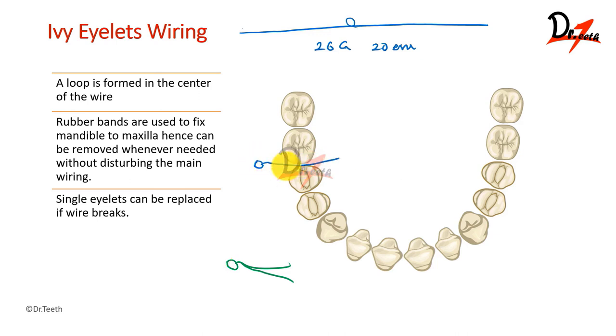We will be passing it interdentally like so. And we will be taking it out from the distal surface of the tooth. Then one wire will pass from within the eyelet and just come out, and here we'll be twisting the ends together. This can be repeated on the other tooth as well. Make sure that whenever you are tightening the wire, the tightening should begin from the molar region of one side, then the other side, and then work towards the incisor area.